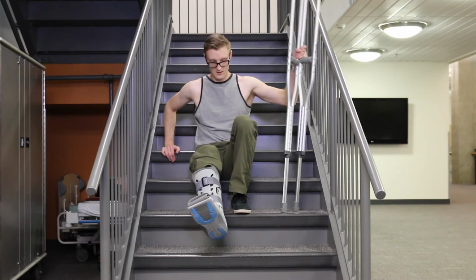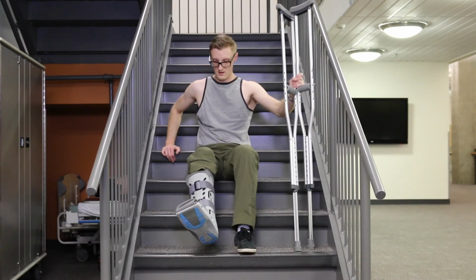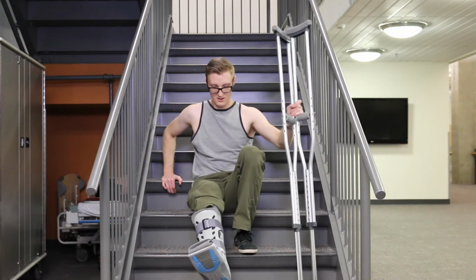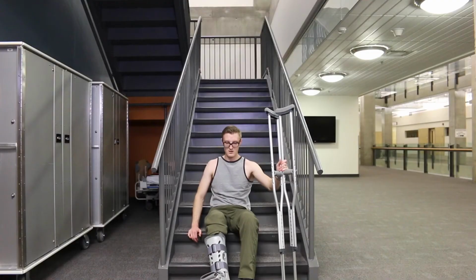Go down the stairs by lowering the crutches, lower the good leg, lower the free hand, and lower down to the next step. Repeat until at the bottom.